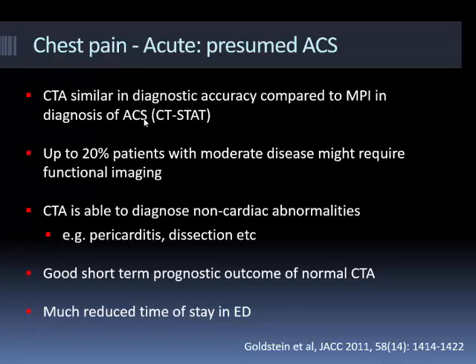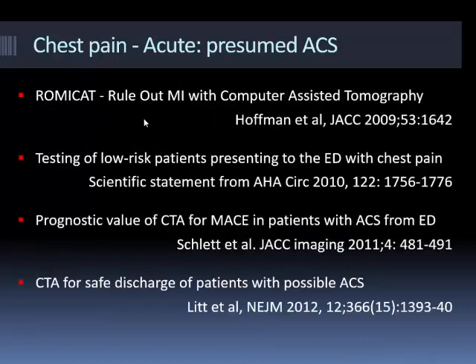Obviously, this has to be balanced against the availability of the technique. What you have to remember, especially if you're not offering CT angiography at the moment, or if you have it in a small setting, is that often the radiographers panic unless they're used to doing loads of these. So it can be very difficult to offer a 24/7 service, and you've then also got the dilemma of who's going to do the reporting, especially if there's only one or two of you doing CT angiography. I think that paradigm will change over time, because there's a bigger push to integrate CT angiography as more of a 24/7 service, and then the registrars will all get trained in it and be able to report them, and obviously get final sign-off, much as any other CT is done at the moment.